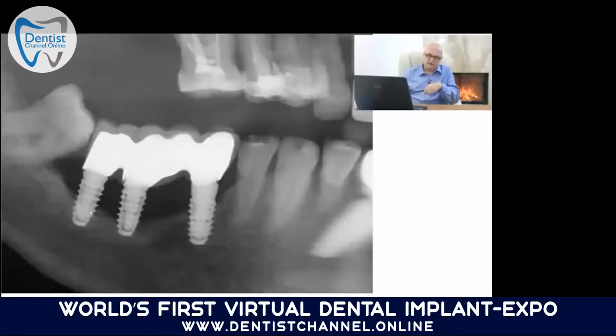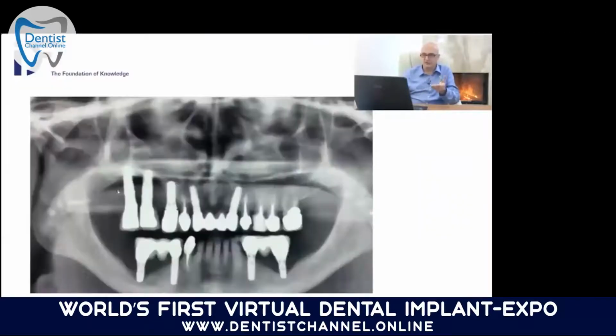Here, for sure, 70% of the endosteal surface of the implant is not in contact with the bone anymore because the bone disappeared, and it works. Here, I would say 90% of the bone is gone, and it works. I mean, the implant is stable. There's lots of infection. The patient doesn't like it. I mean, there's chronic infection, pus day and night. This is not a question. But the implant works. So why does it work?